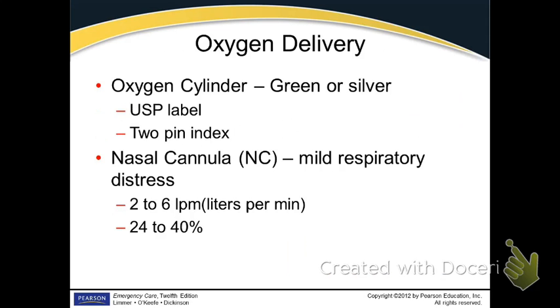You always lay an oxygen cylinder down. Never leave it standing up anywhere. You notice I had her hold the oxygen cylinder. If that was to get knocked over and that neck break off of it, then you have a rocket, right? Oh yeah, big time. So if this was to fall off and hit the ground and this neck broke off, this part right here, the neck, would go what direction? That way. And it's been documented that this has happened before, and they documented that the neck of that oxygen cylinder ended up in several exam rooms. It went through walls. So this would go through that wall without any problem.